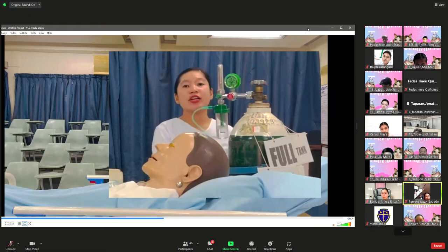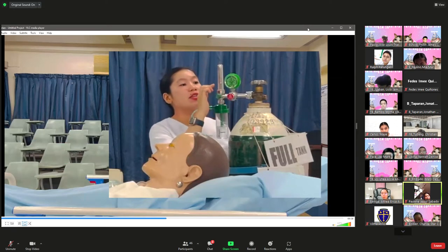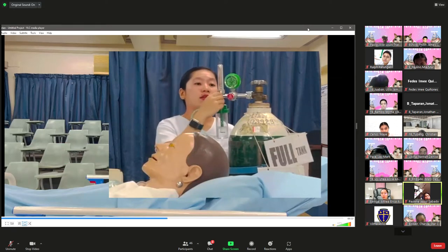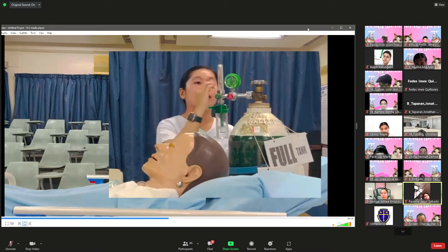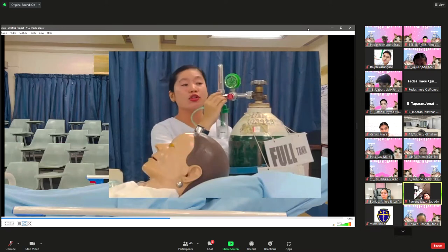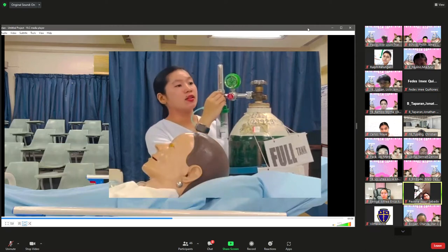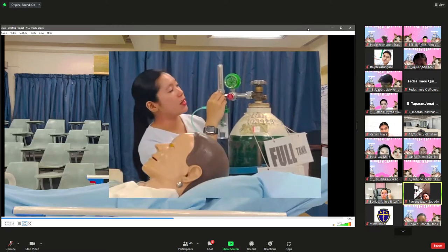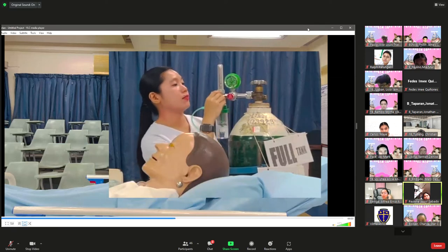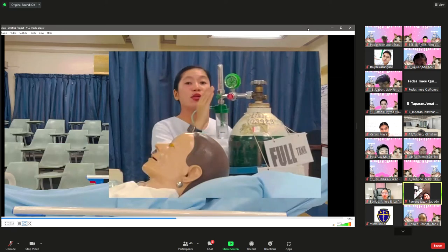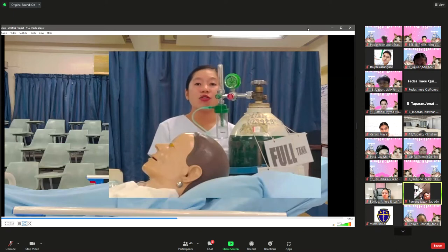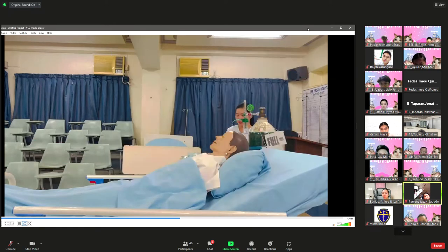Open the flow control valve and check that oxygen is flowing freely through the tubing; feel the oxygen at the tip of the nasal cannula. If the doctor ordered 3 liters per minute, adjust the flow meter so that the lower border of the ball is at the desired flow rate — in this case, 3 liters per minute. This ensures the accurate amount of oxygen is being delivered to the client.